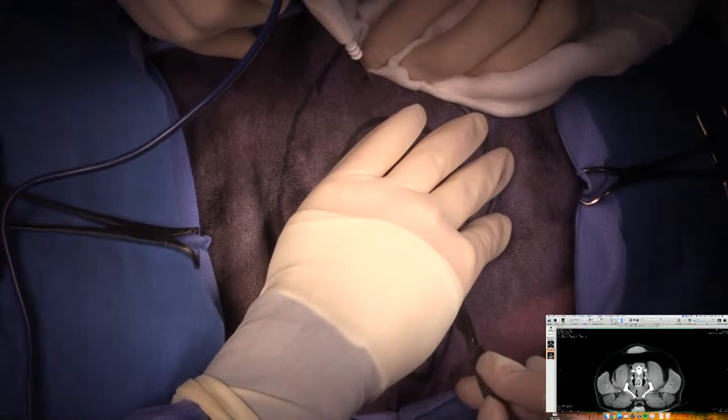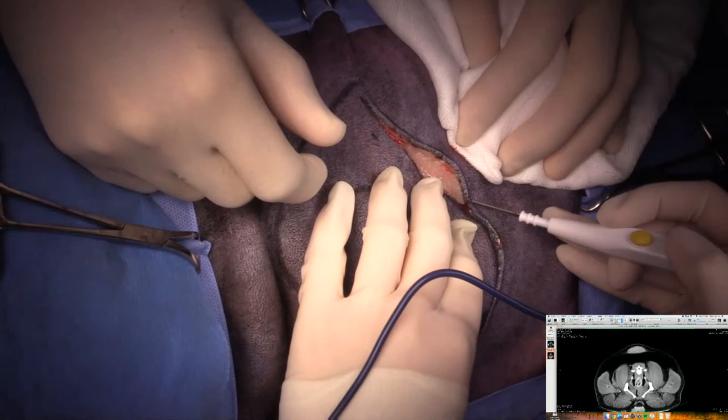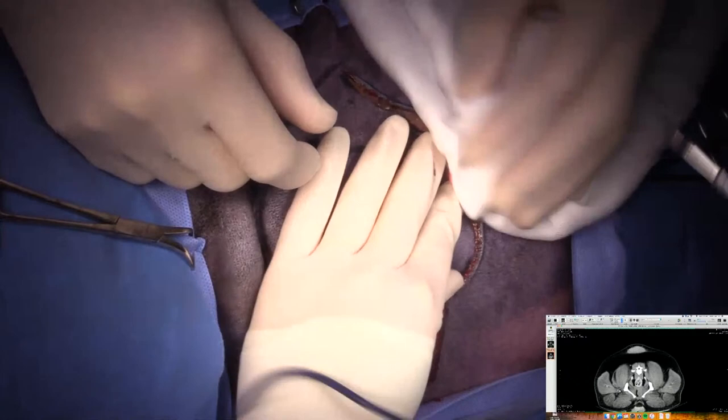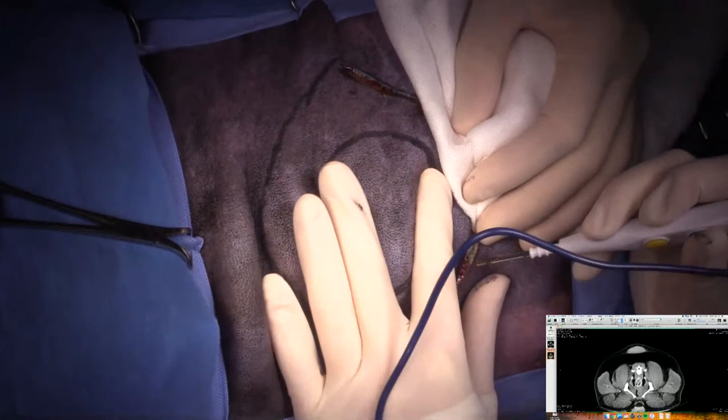And we are going to take lumbar fascia deep to the tumor as a deep margin. That's probably not necessary given its appearance on the CT scan. The other thing that's important to notice about this mass is that it is a sub-Q mast cell tumor as opposed to a skin mast cell tumor. And those, in general, behave a little bit more nicely than skin mast cell tumors by and large.